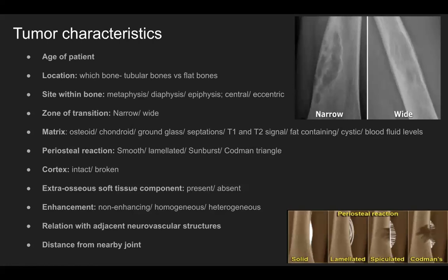Similarly, if a tumor is in the spine, then we have to note whether the tumor is involving the body of the spine or the neural arch of the vertebra.